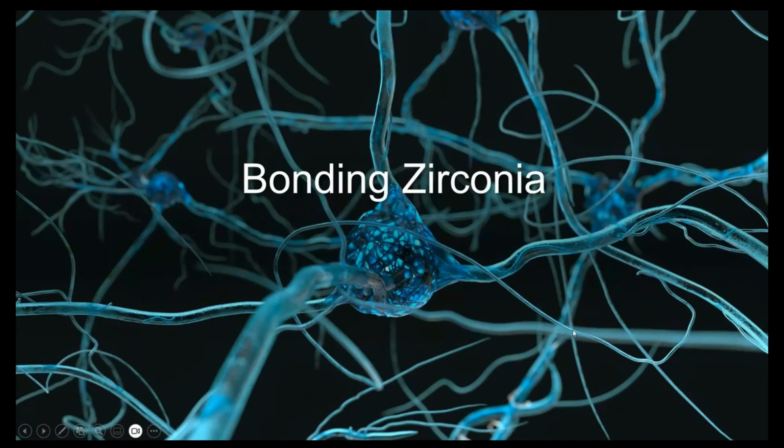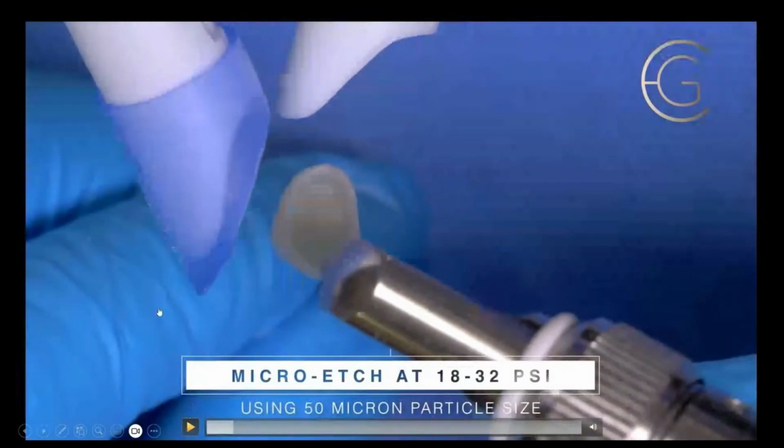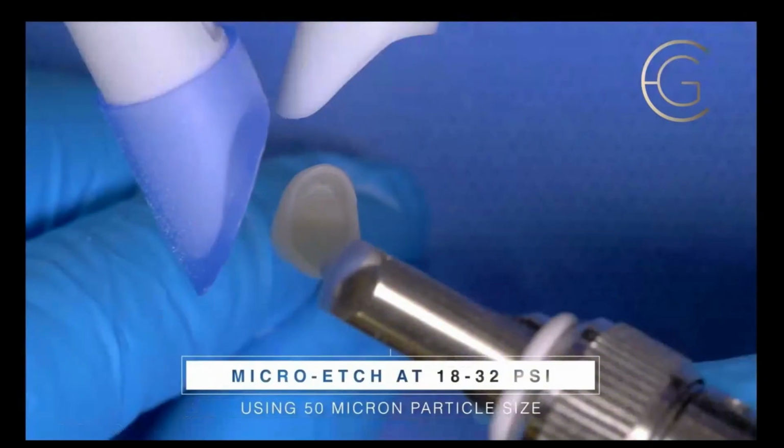So let's talk about bonding zirconia. That's how you handle it. You're gonna love this. Doctors, if you order a zirconia crown from the lab, please ask them not to air abrade it. Because if they air abrade it and then send it to you and it sits on your shelf for more than 36 hours, your bond strength goes down by over 35%.